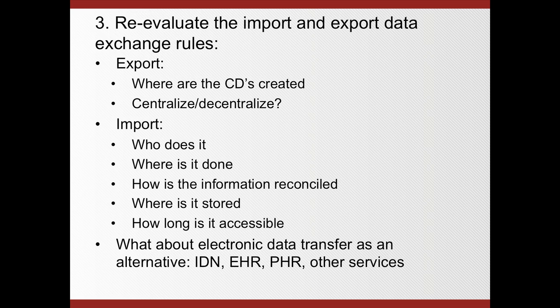So with regard to the import, who takes these CDs? Do we want to again centralize it, decentralize it? Is it the PACS administrator? Is it the technologist? Is it the front receptionist? Is it the front desk? So rethink who's doing that, and then at what location.